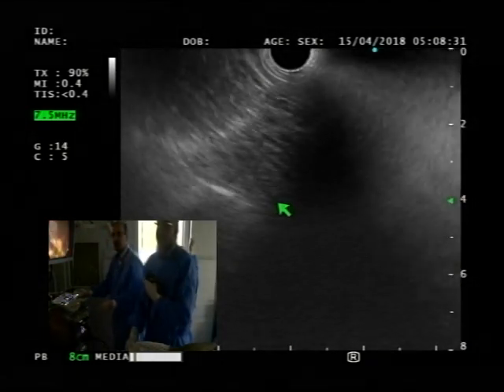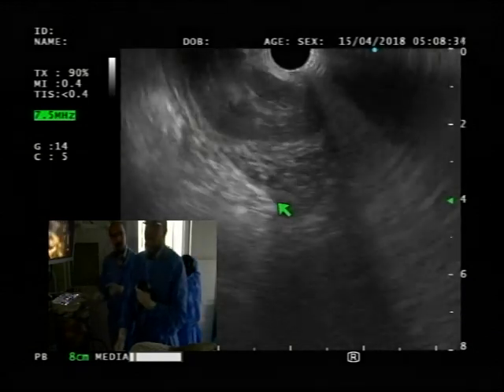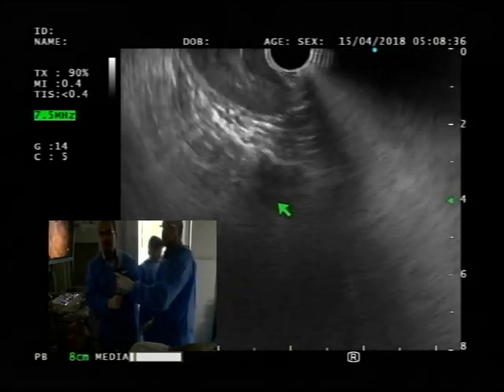You've fallen, yeah. Do you want me to show you just one? Yes. Okay, and then we can definitely do it.